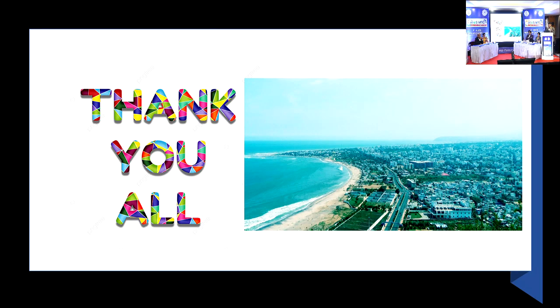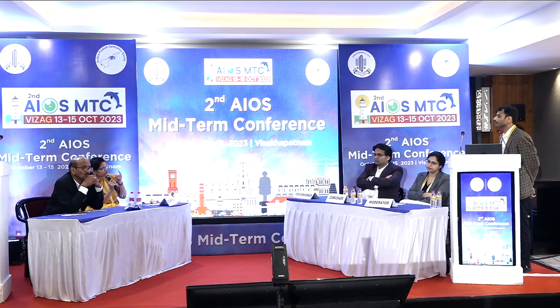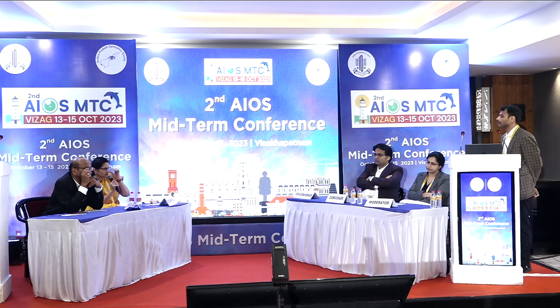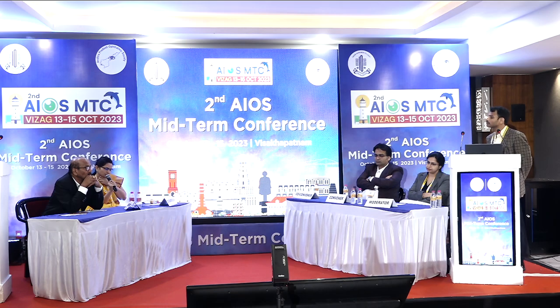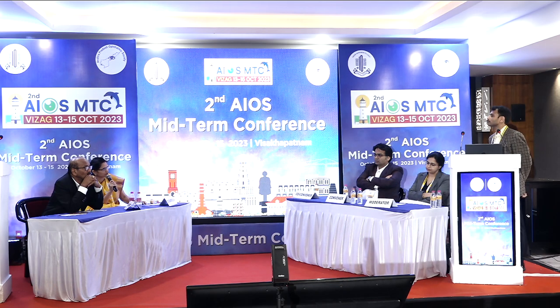Thank you very much. Very nice presentation, Dr. Vishnu. I just wanted to add a couple of points. Like you mentioned, for perforated corneas, it's essential to take very sharp, new, fresh trephines and go very slowly, so you're like slicing through butter. That is one point. And the other thing is, in case of routine optical keratoplasty, where you want to be sure of your visual outcomes, use suction trephines. They are now regularly available, and you have those with central markers which help you to orient it. Always mark the center of the cornea before starting the case.